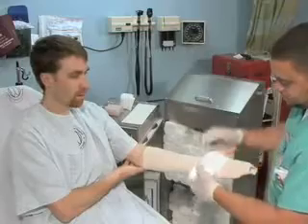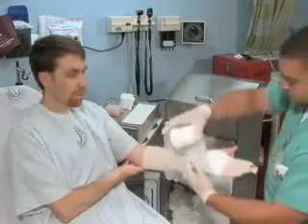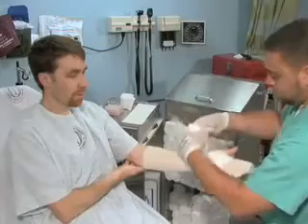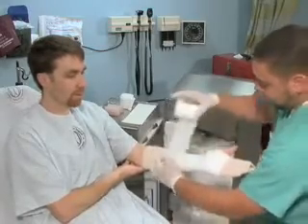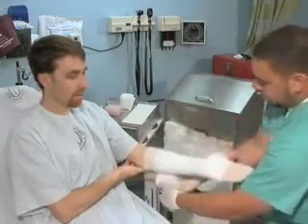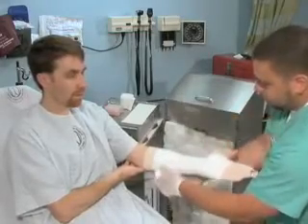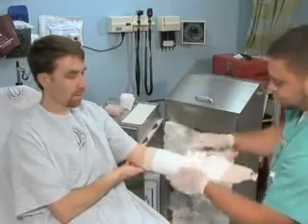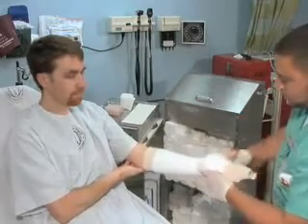Use cotton padding material to pad the injured extremity for comfort and to allow for anticipated swelling. Wrap the padding around the extremity, overlapping the previous layer by 25 to 50% to place 2 layers of padding over the entire area. In areas of bony prominence or expected irritation, apply extra layers of padding. If substantial swelling is expected, continue wrapping for 3 to 4 layers of protection. The cotton material can easily be stretched or torn as needed for uniform application. Take care to avoid too much circumferential pressure caused by excessive stretching of the padding during the application.